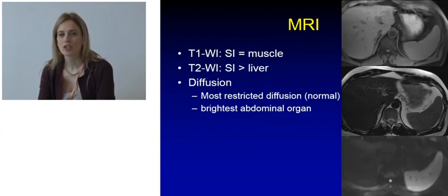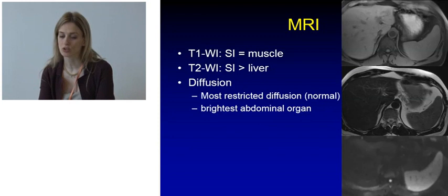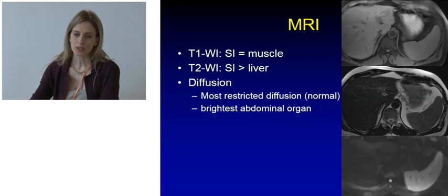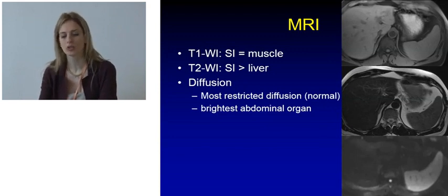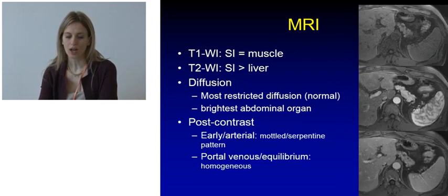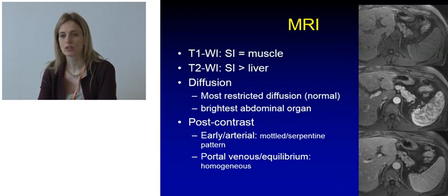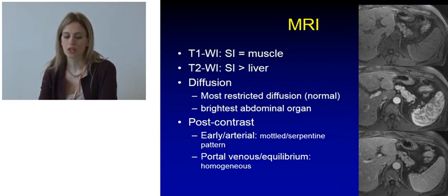On MRI, the signal intensity on T1-weighted images is iso-intense to the muscle and on T2-weighted images it's hyper-intense to the liver. On diffusion-weighted imaging, the spleen is characteristically the brightest abdominal organ because it has the most restricted diffusion. After contrast administration, we see the same enhancement pattern as for CT, with the mottled enhancement pattern on the arterial phase and the homogeneous enhancement in the venous and equilibrium phases.